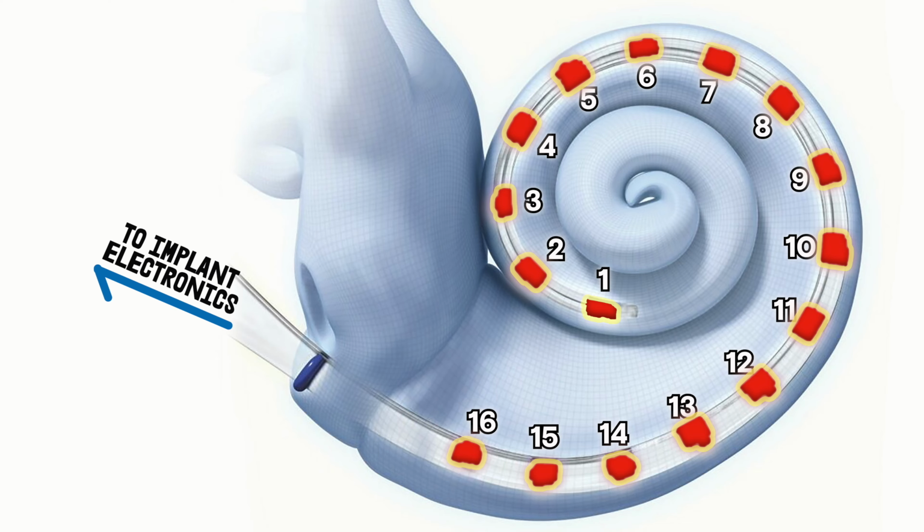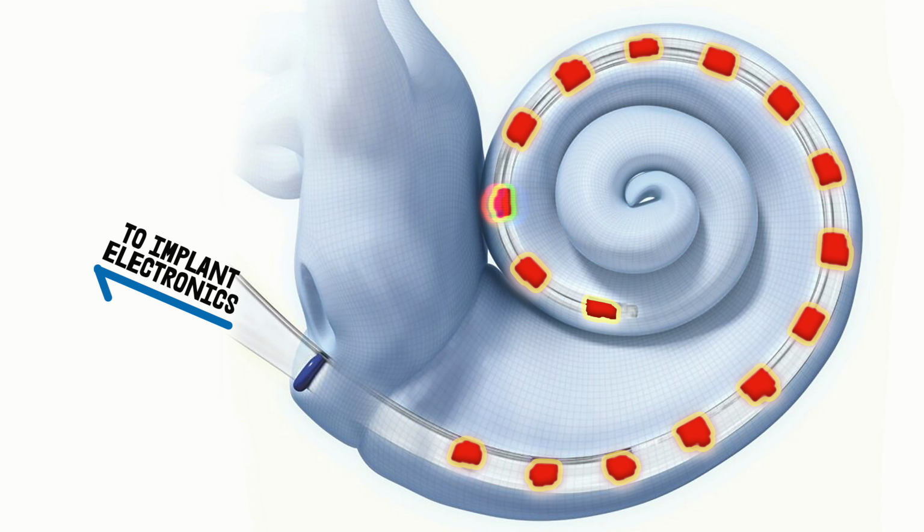But if you have a cochlear implant, those hair cells at that specific location are probably a distant memory. Instead, you now have 16 electrodes, well, in the case of Advanced Bionics anyway, and you'd better hope that the one that is trying to send you the signal for 440 Hertz is pretty darn close to the specific place along your auditory nerve that is primed and ready to hear that frequency. And therein lies the problem.